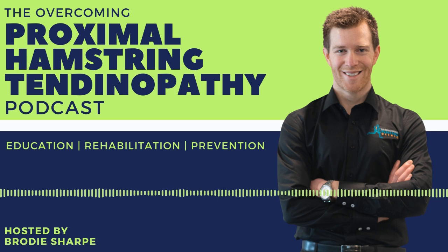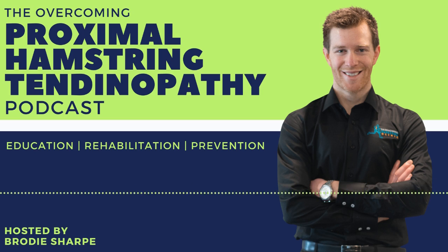So I had this 42-year-old female runner who had a nagging Achilles tendon, not a surprise there, and she had a big event. She had Shockwave, because I never give Shockwave before an event for at least 8 to 10 weeks, because the problem with Shockwave is it can numb the pain and you overdo it. So she had Shockwave. Obviously, she had a good result, and then she did the marathon or half marathon well.